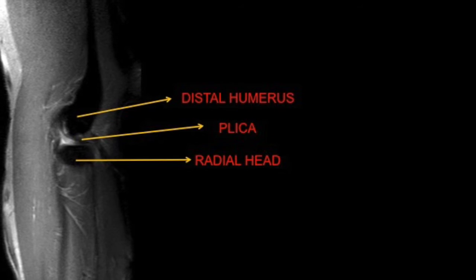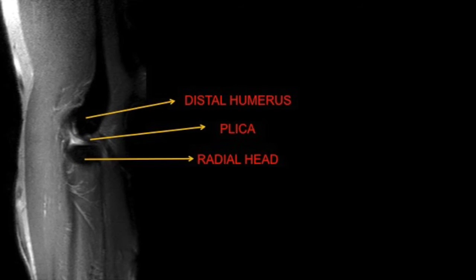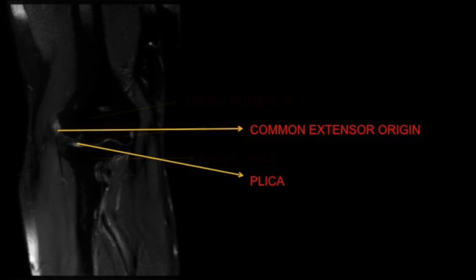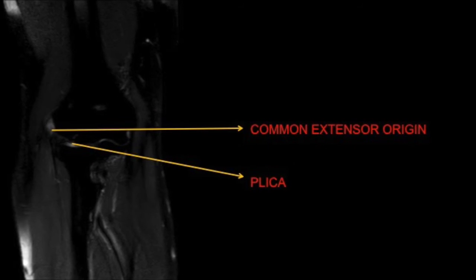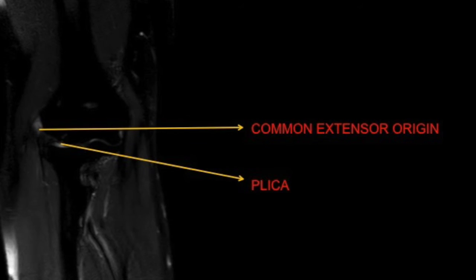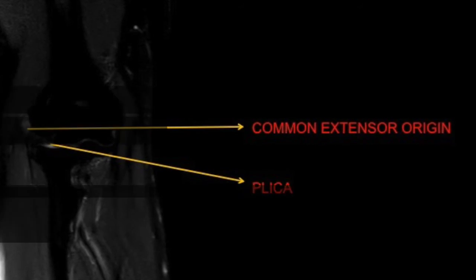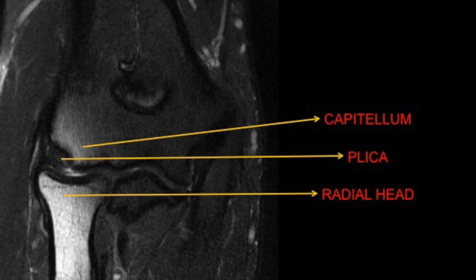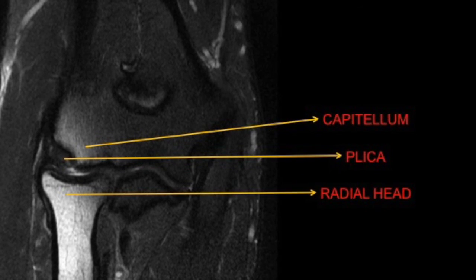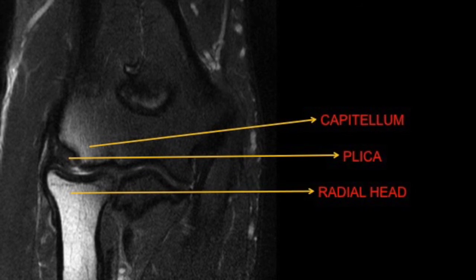The most common plica in the elbow is the radiocapitular one, at the posterolateral aspect. It fills the joint space and typically does not allow complete extension of the elbow. Repeated stress leads to chondromalacic changes, as we see in the capitulum in this case.